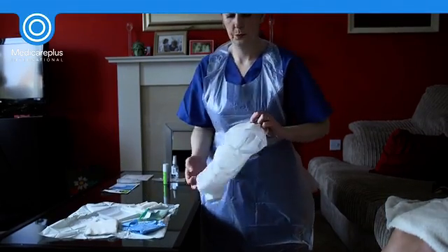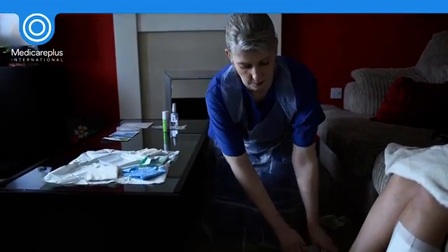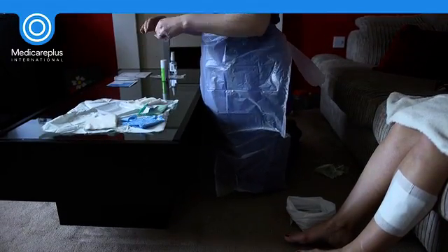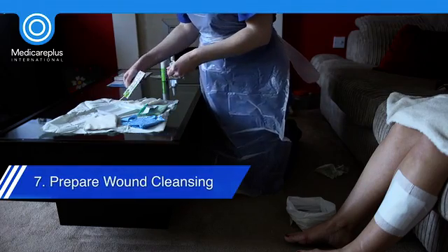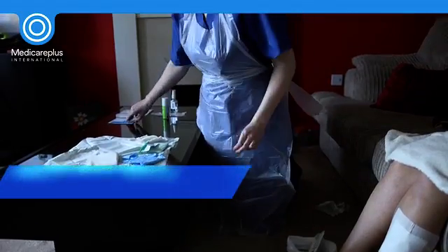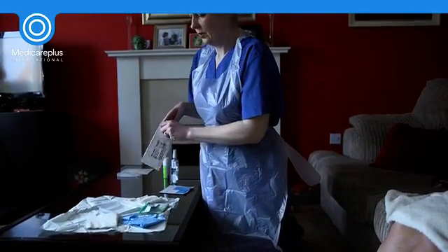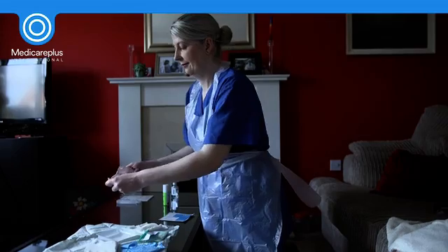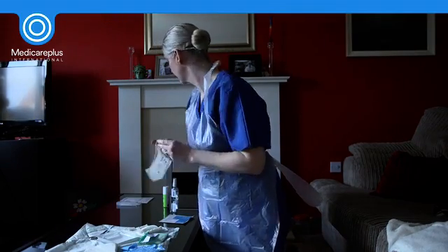Once your equipment has been arranged, invert and place the waste bag in a convenient place so that soiled dressings and equipment are not taken across the sterile field when removed. If a large volume of tap water is to be used for cleansing or immersion of the wound or limb, line a clean dry bucket with a clean plastic bag and fill it, then position the bucket in a convenient position close to the patient.